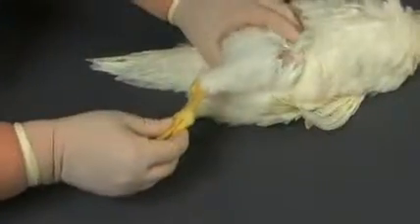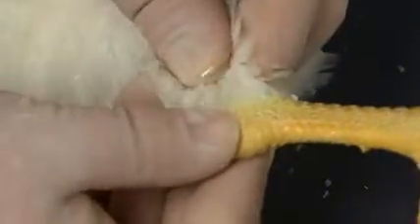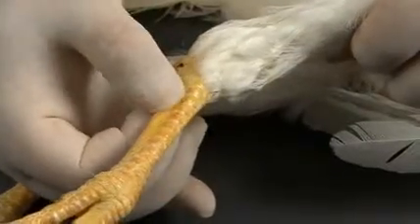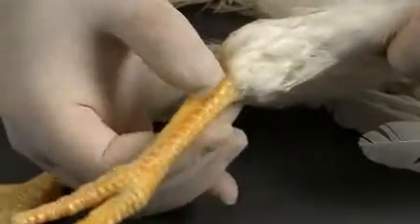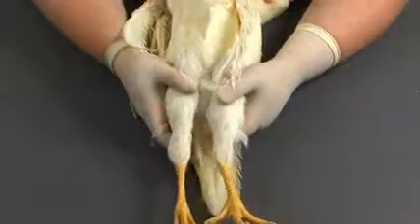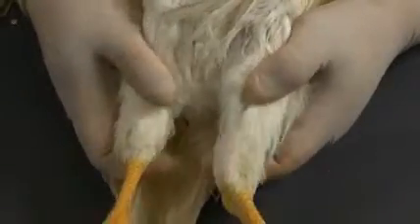Flex and extend all the joints to assess range of motion, keeping in mind the effects of rigor mortis. Palpate the joints for swelling or effusion. Palpate the tendons. Assess them for swelling, that may be indicative of tenosynovitis, or laxity associated with tendon rupture. Examine the musculature of the legs, noting symmetry and tone. Asymmetry in size may indicate muscle atrophy, resulting from injury or damage to the nerves of the limb.